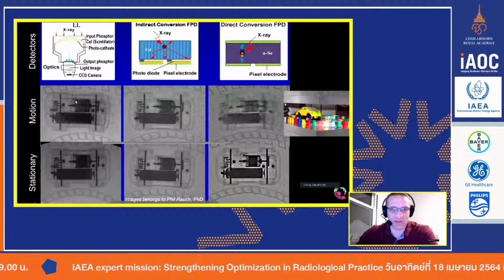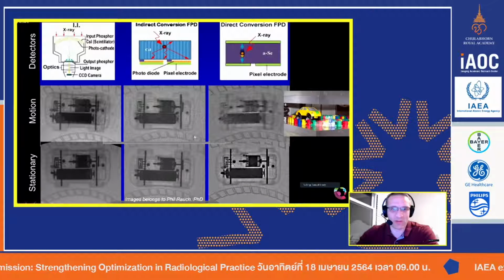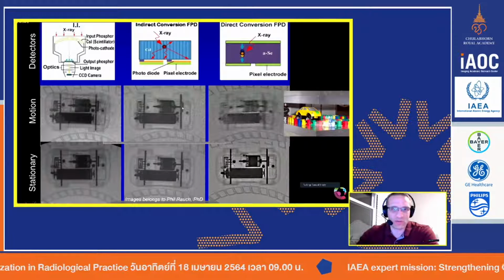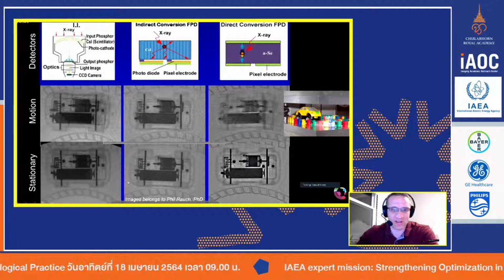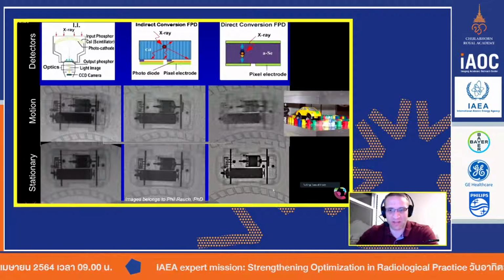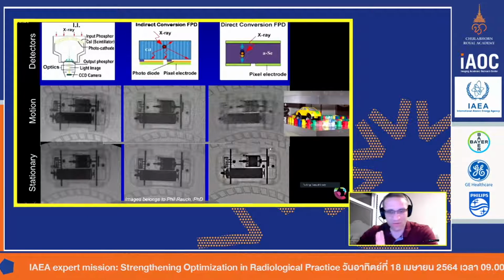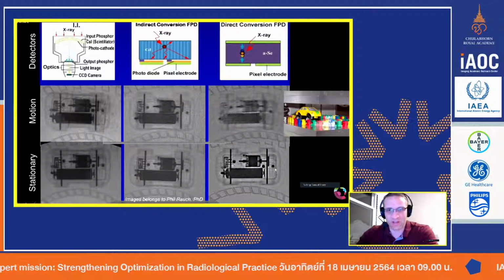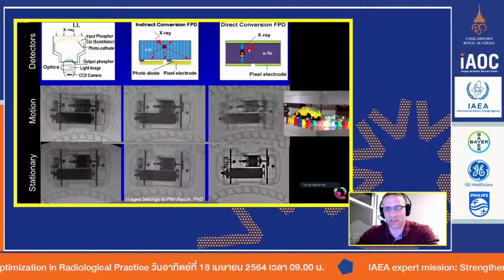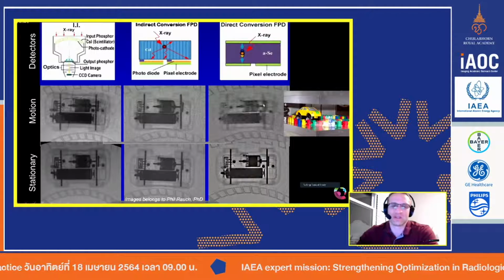So what you typically use is either an II: stationary, pretty good. Motion, it's definitely going to be blurry. And the same with indirect. We mentioned that you're going to get pretty good sharp edges in motion with an indirect. Stationary, once again, still pretty darn good. And then the best stationary image of this car, of course, is going to be the direct conversion, but motion wise it's really slow, and that's just because to convert an X-ray and read out the signal, it's a little slower process, so that's why it's a lot more blurry.